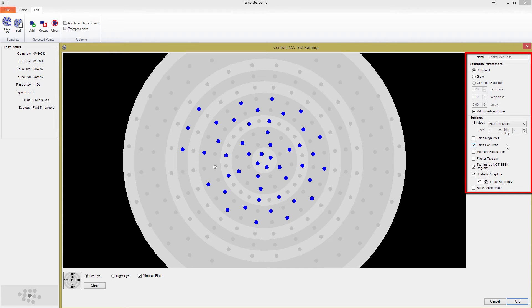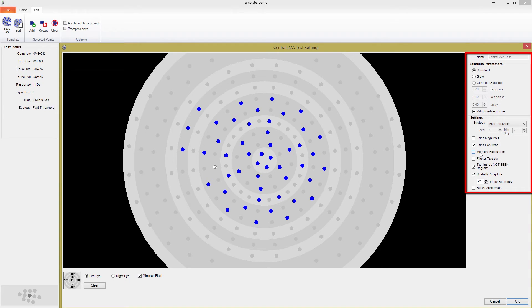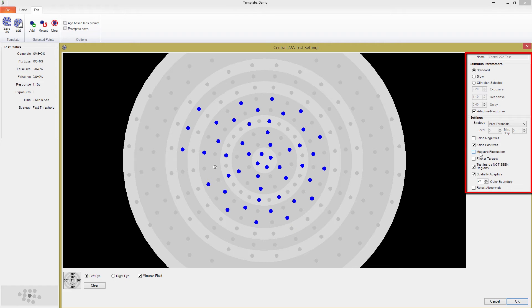The fluctuation measurement option is another indicator of test reliability. When the test is progressed to an appropriate stage, four fully thresholded points that have large defects are chosen. These points are retested four times each. At the end of the test, the average of the four threshold levels are calculated, and a standard deviation is determined to give a single fluctuation measure for the test. Especially in patients with low vision, fluctuations can be very large around areas at the borders of an absolute defect.